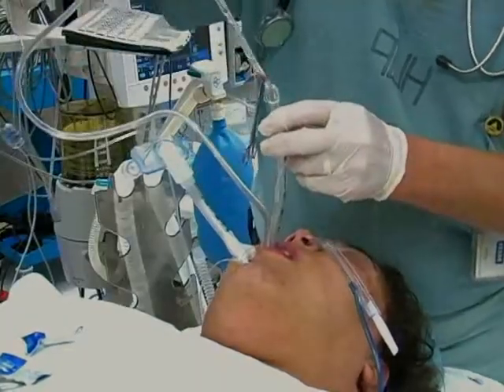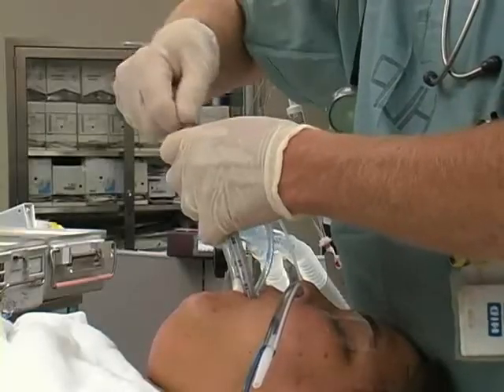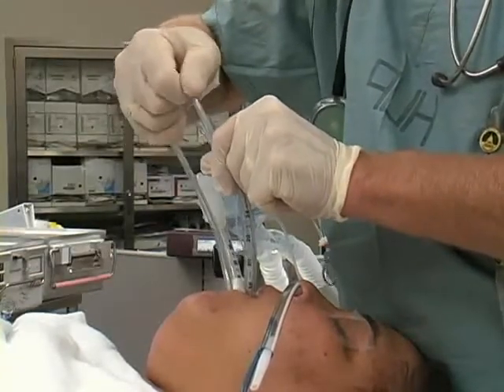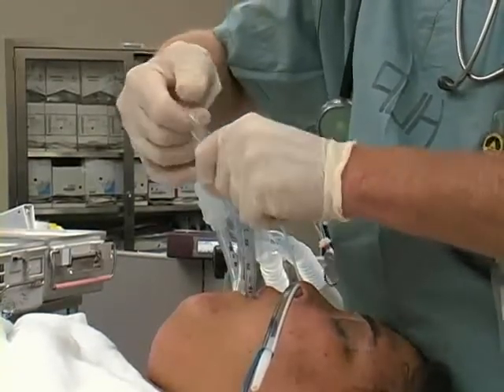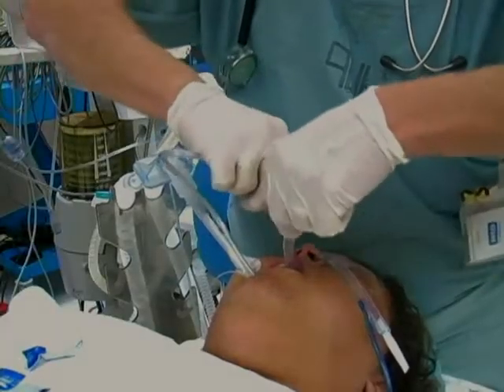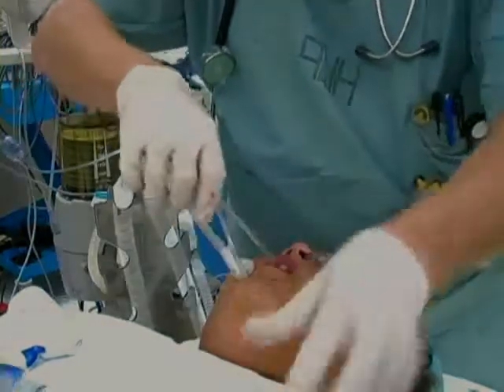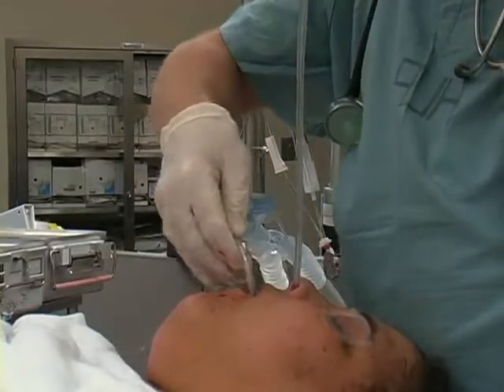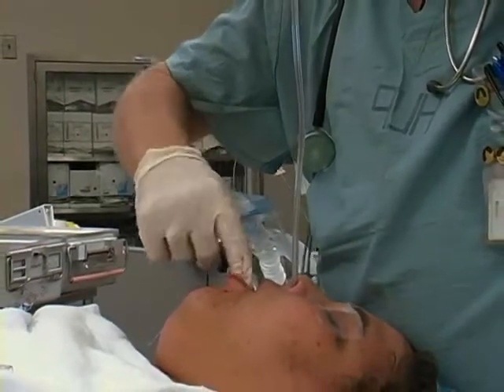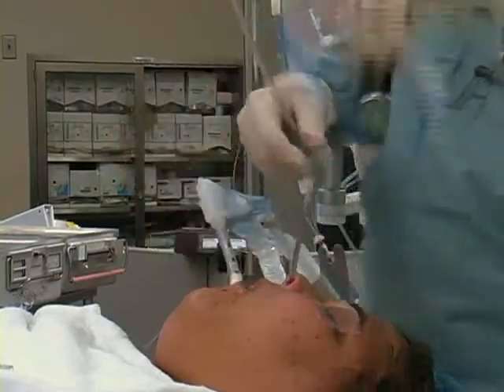Insert the NG tube tip into the endotracheal tube. Push the NG tube through the cut endotracheal tube until the tube will no longer easily advance. Remove the cut endotracheal tube by peeling it around the NG tube via the previously created slit. Gently pull the NG tube at the naris to straighten the tube such that it lies flat in the posterior oropharynx.